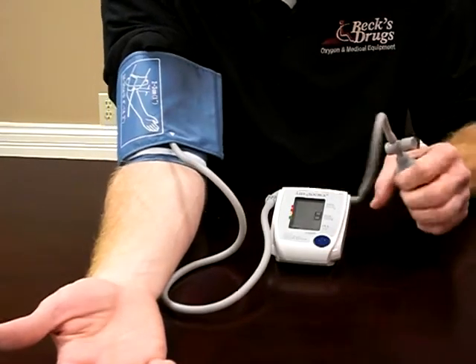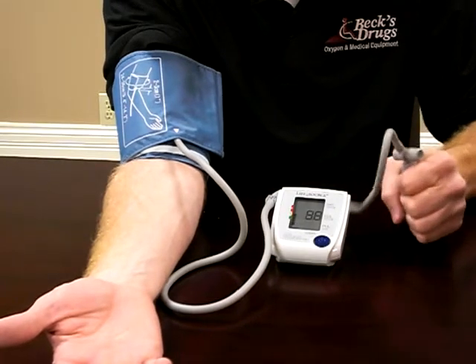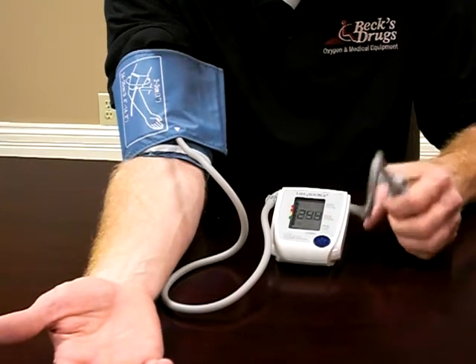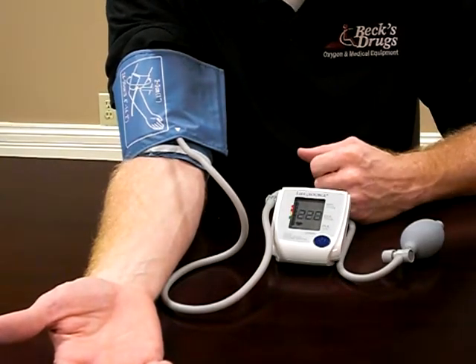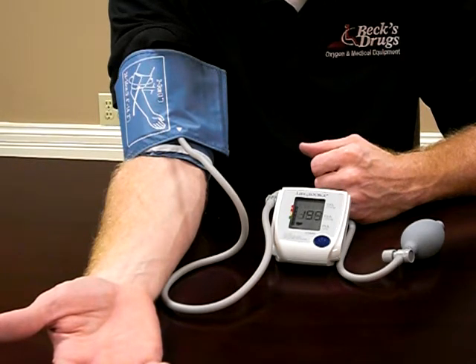You just start pumping it up. I would pump it up over what your highest reading would be — most of the time up over 200 or so, or higher if you need to. Then once you pump it up to that, you just quit pumping and the machine does the rest. It just takes about 30 or 40 seconds, and then it will read out your blood pressure and your pulse.